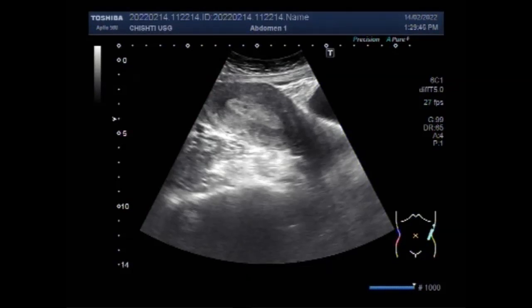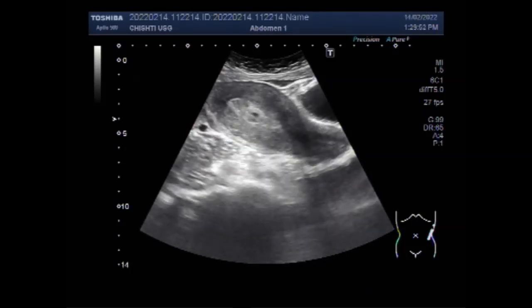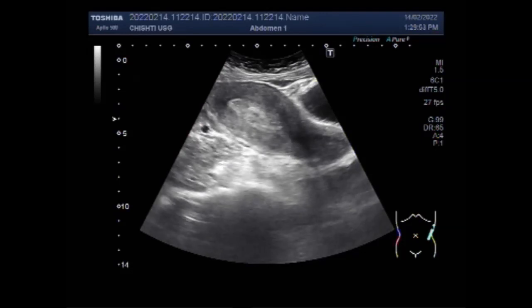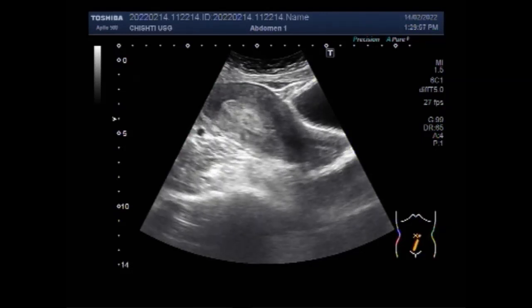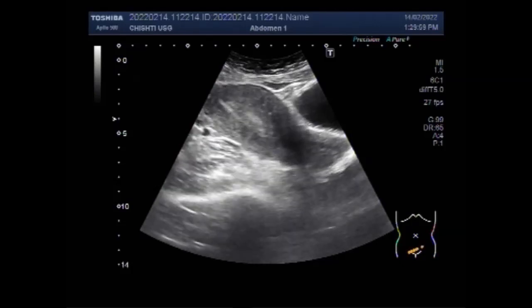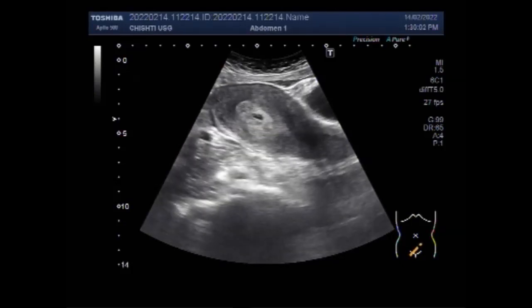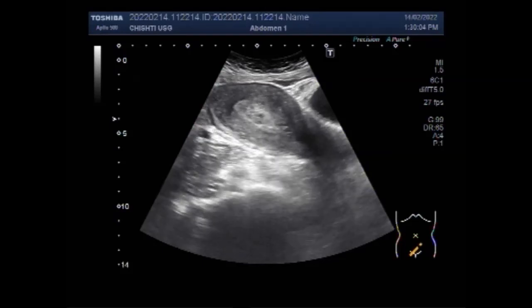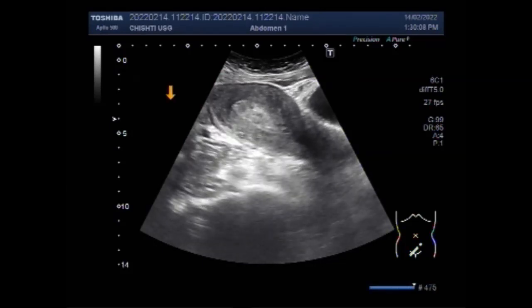Dear viewers, I hope you are all fine. This ultrasound video shows a case of uterine polyps, also called endometrial polyps. Overgrowths of cells in the lining of the uterus — that is the endometrium — leads to the formation of uterine polyps. Endometrial polyps are a common cause of abnormal uterine bleeding.